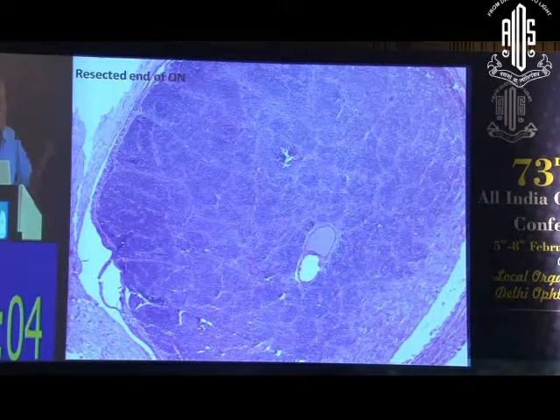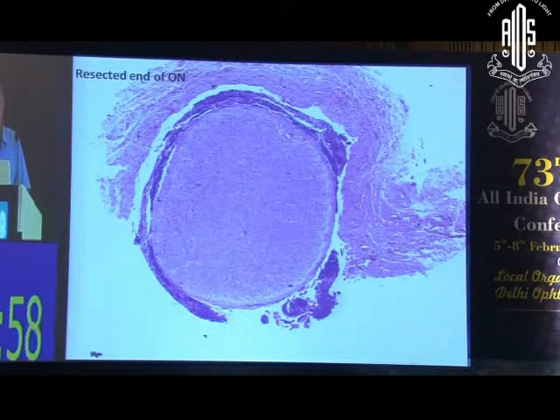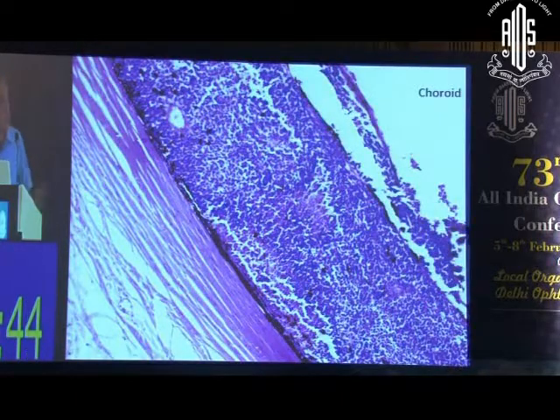You have the tumor over here. That's another resected end. Is this involved or not? No, right? It is? Very good. There is involvement of the meninges, and that still counts as T4. The parenchyma is not involved over here. Okay, this is how choroidal invasion would look like. This is full thickness choroidal invasion.